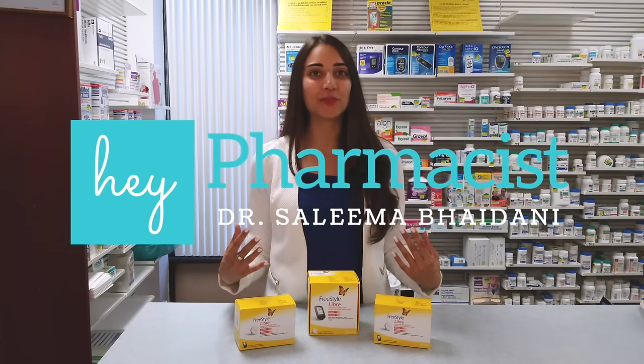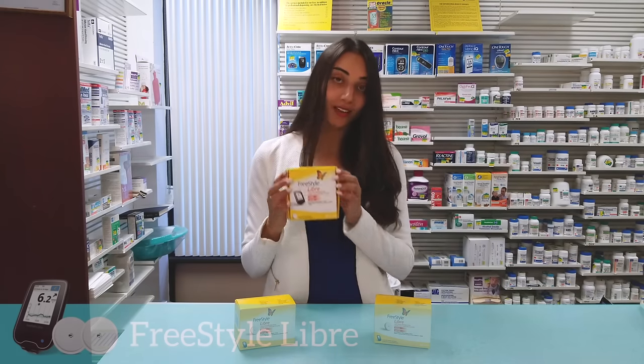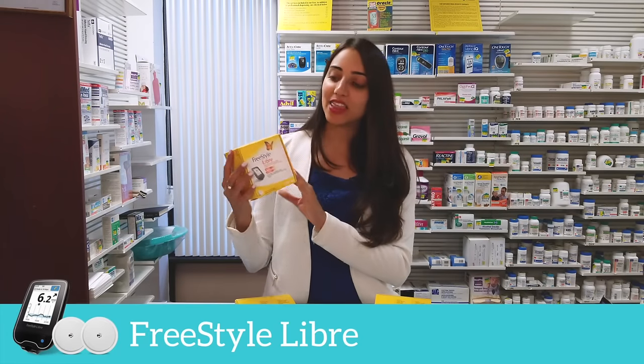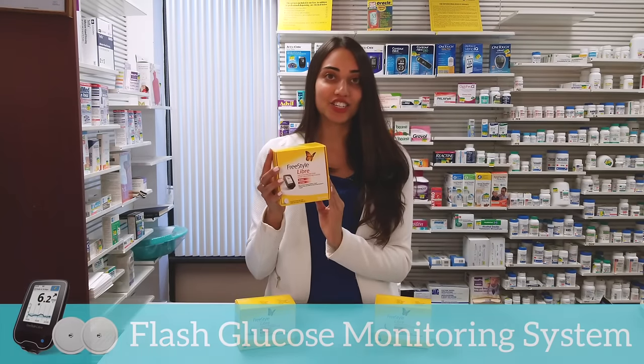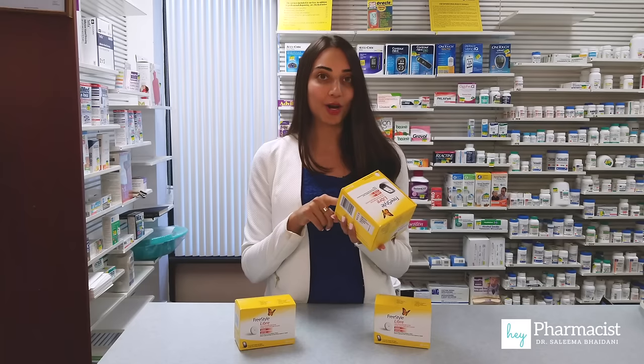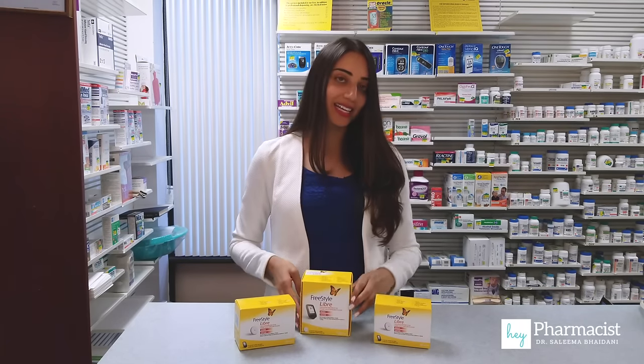Hey pharmacist, welcome back to the channel. Today we're doing something a little bit different. I've got the Freestyle Libre in front of me and this is the world's first flash glucose monitoring system. I'm excited to share this with you. We're going to do an unboxing and in front of me I've got the reader as well as the sensor.